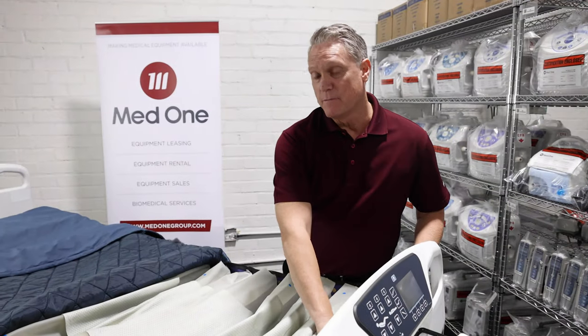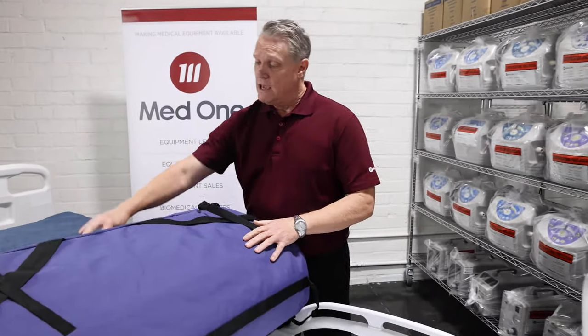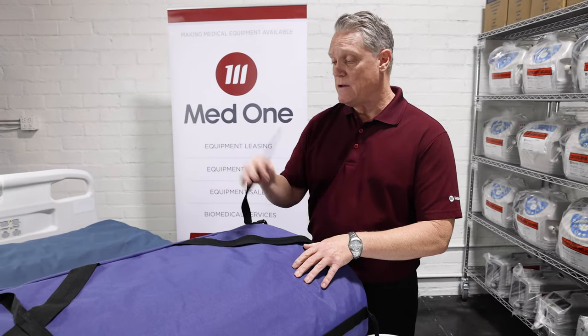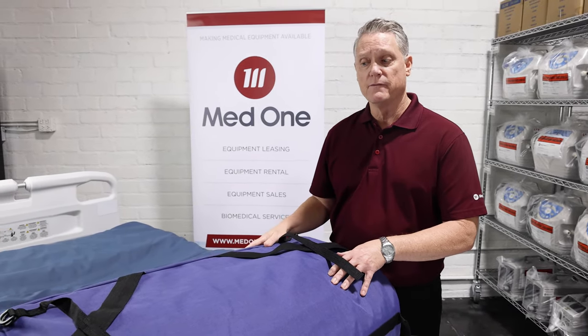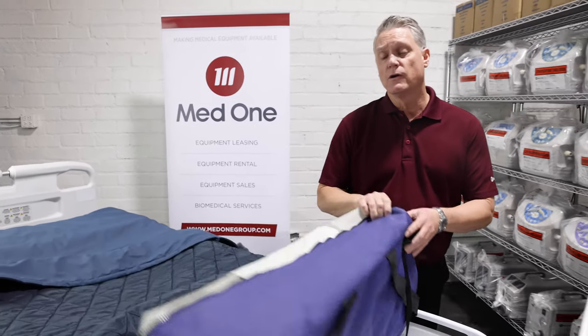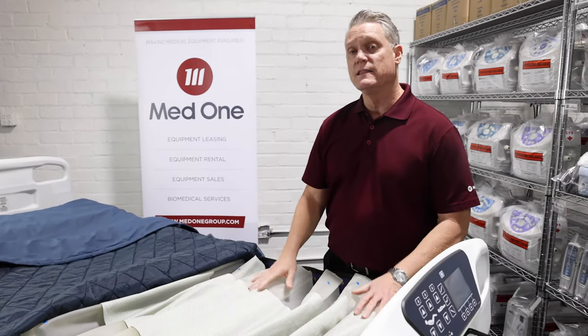And now let's look at the bottom side of the mattress. Each mattress has six tie down straps and four corner straps so you can safely and securely fasten it to your bed frame. Next, we're going to connect the control unit to it and inflate the mattress.